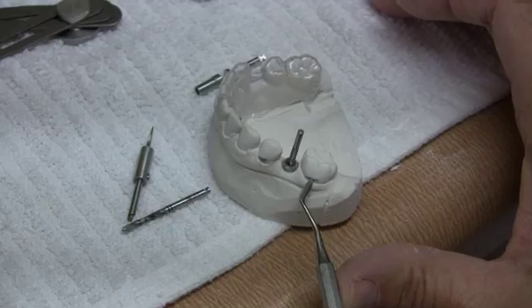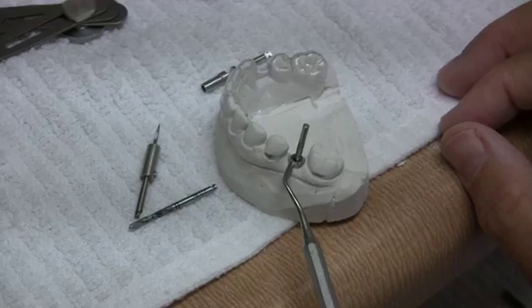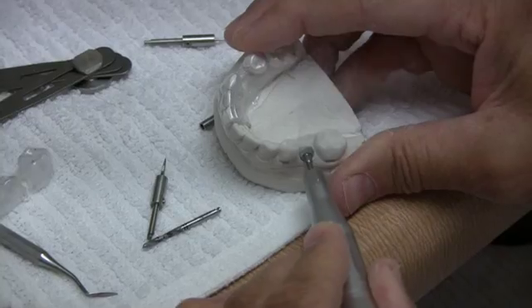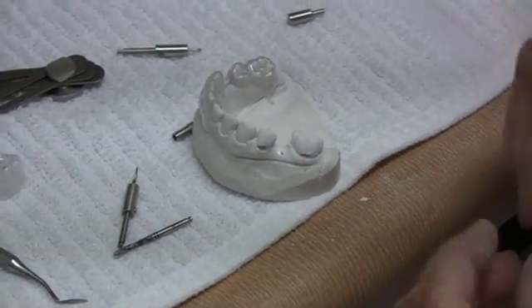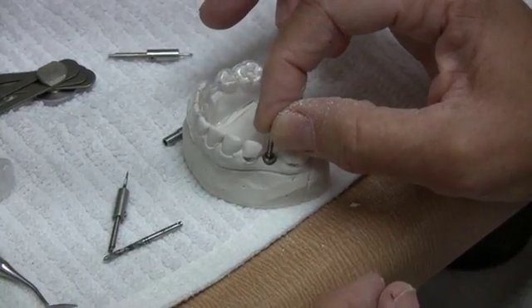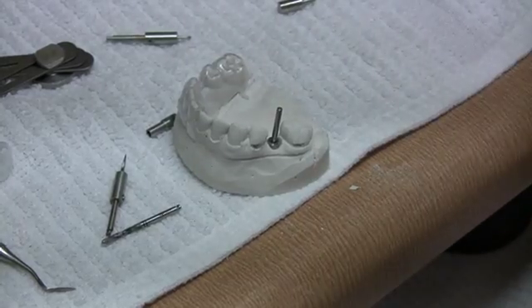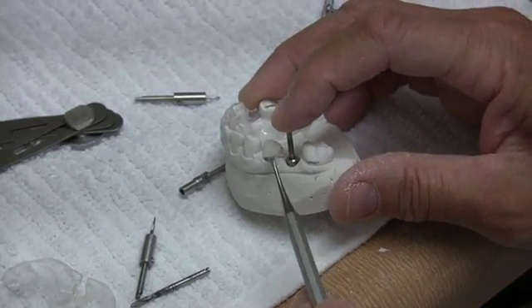Adjustments are made to the crest, establishing the vertical platform position before enlarging the osteotomy. With this approach, the ridge is modified to allow the platform position in the proper vertical position before the osteotomy is prepared to full depth and dimension. In this way, the polished collar will not be placed subcrestal, which would cause loss of bone from the neck of the implant.